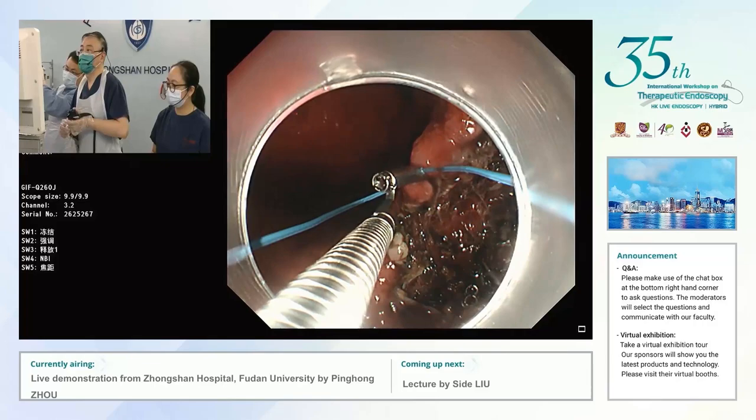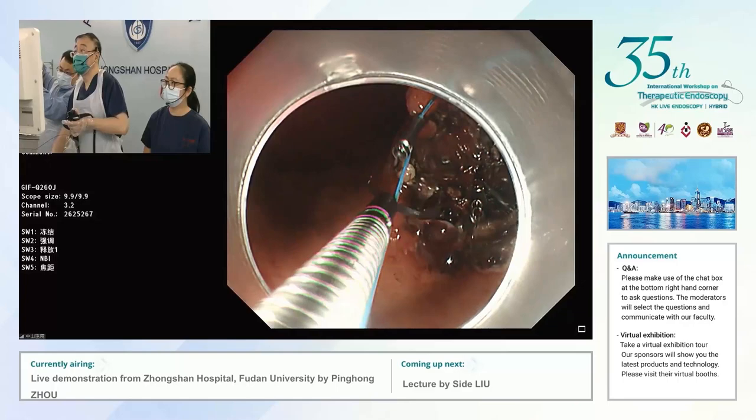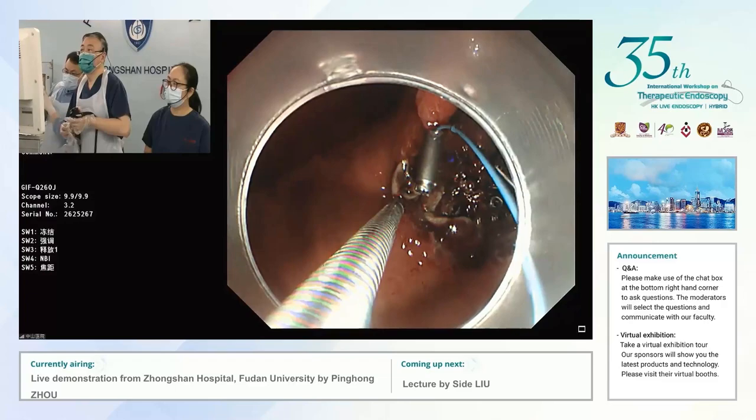But the defect is larger than the loop, right? Yes. So I guess when you go around the perimeter of the defect, the loop is probably not quite big enough. You can apply multiple loops — you can apply several loops.